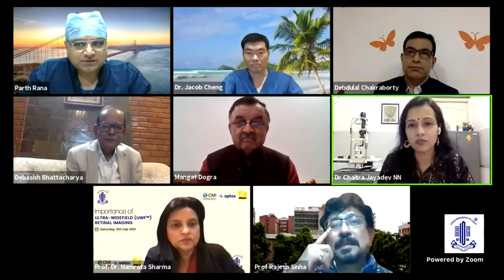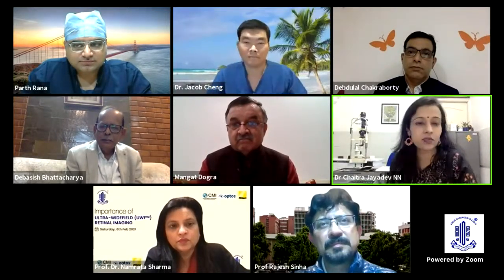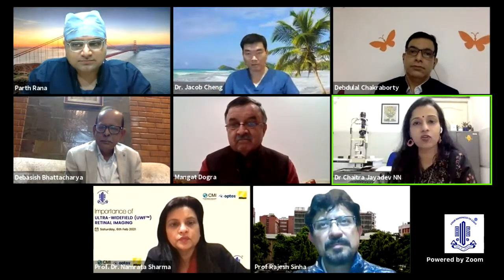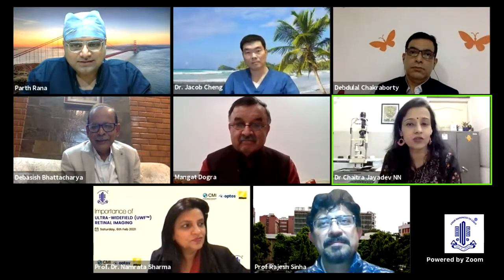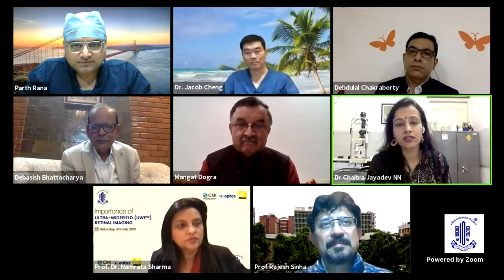Yes, we actually published a similar thing recently, Rajesh, for the refractive special issue. We pulled out some images and compared them with clinical findings, and looked at how many lesions we had actually missed clinically but confirmed on imaging. Whatever is said and done, when you're looking at the entire retina, sometimes you miss a particular clock hour and you could have missed a small hole there. So for all refractive patients, we pulled out their Optos images and went back to our records. It was a little shocking for the retina team. But there is a factor of human error, which is overridden by the objectivity of imaging. So we've done a small study on that as well.